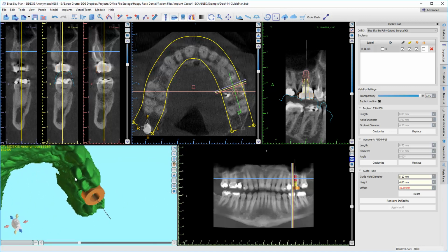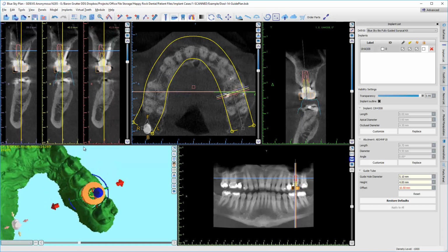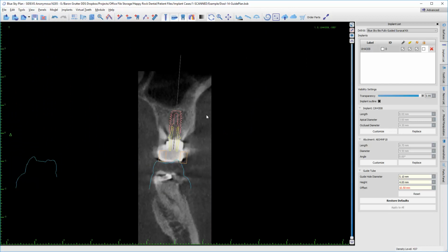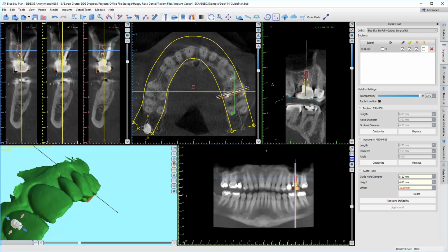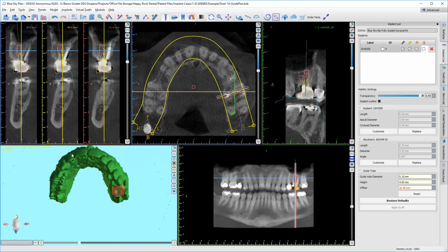If I look at it from this view, I could see that this maybe could tilt a little bit this way, and let me see what that did to my plan. Not much, maybe swing it in just a little, keep it a little more centered, and let's look. It's one of those changes I'm making on the fly that, is it really necessary? Probably not, but I'm looking at this image and it gets me to start to think, and the more time you kind of waste on the computer. And if you look, this patient's actually sort of constricted, tipped in.